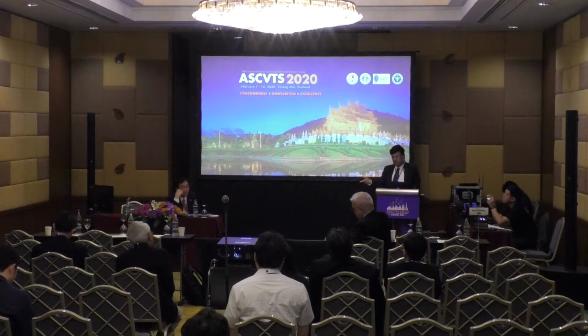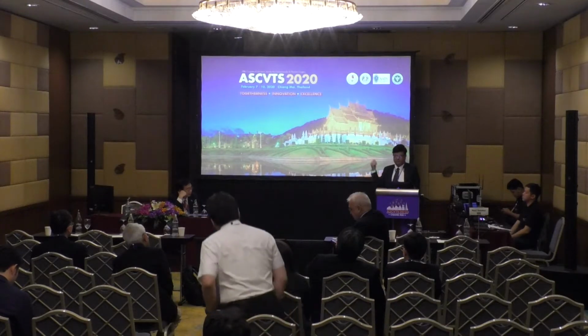So a CT angio is a very good tool, and that CT angio can be used for 3D printing. That 3D printing helps you a lot. And now there is the advent of virtual dissection. So if you do have a virtual dissection, you can very reliably tell what is the nature of the obstruction and which path you should take the patient on. The technology is available. It's not available everywhere, and it costs money also. But the diagnosis can be very accurate.